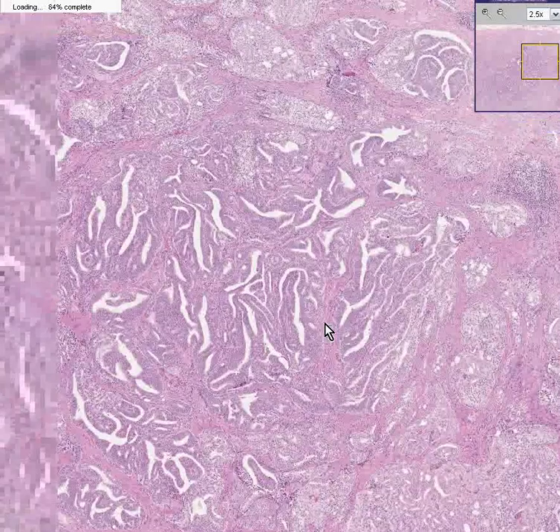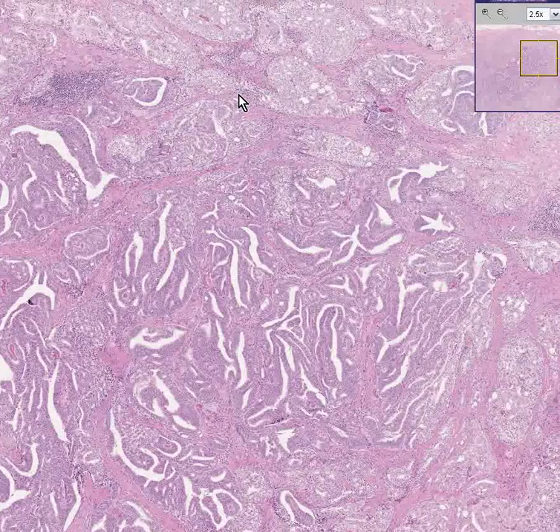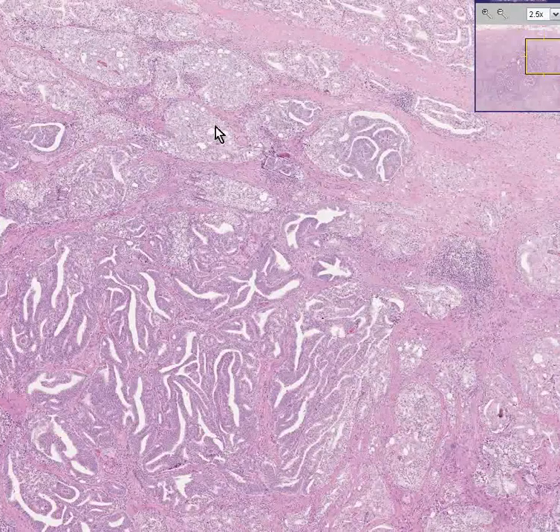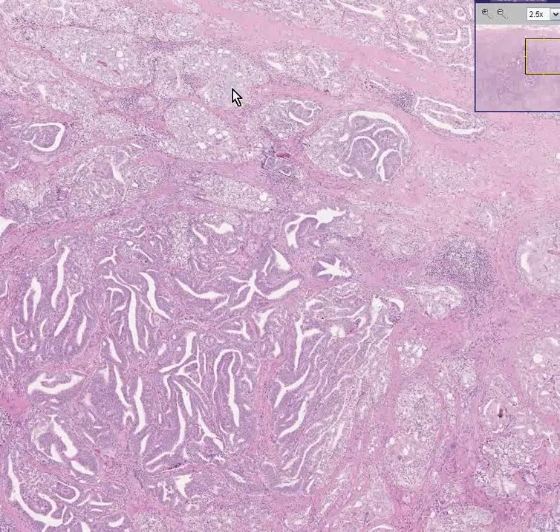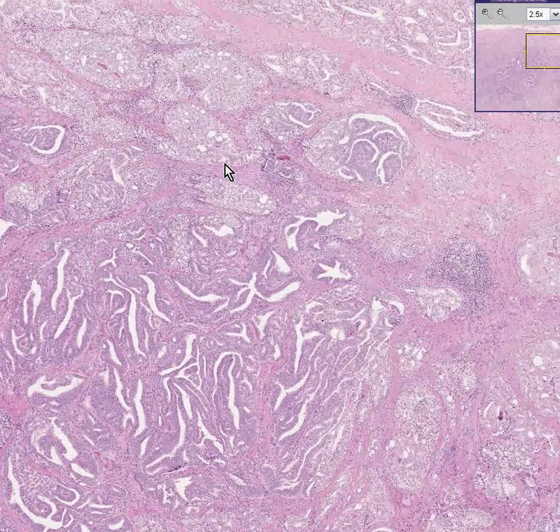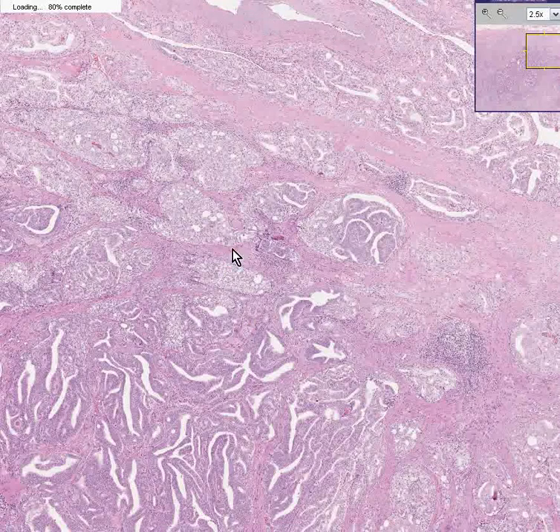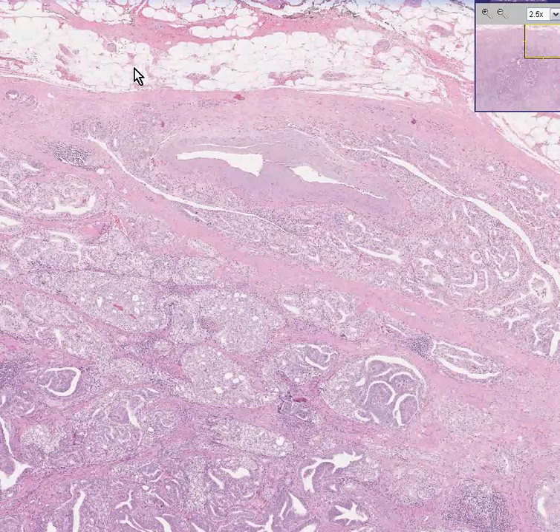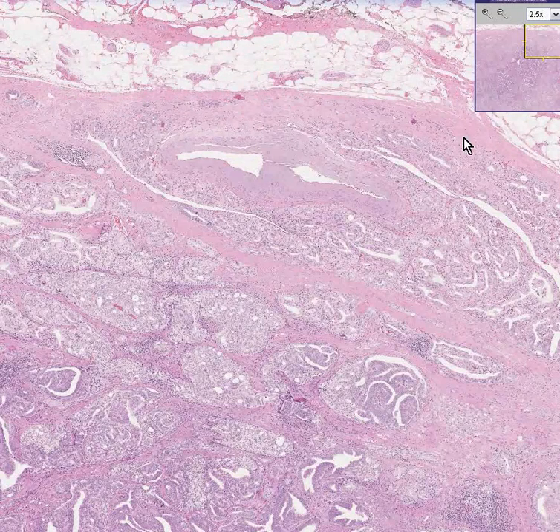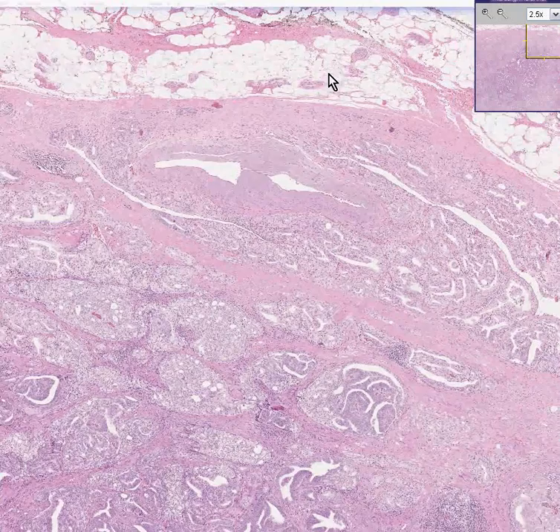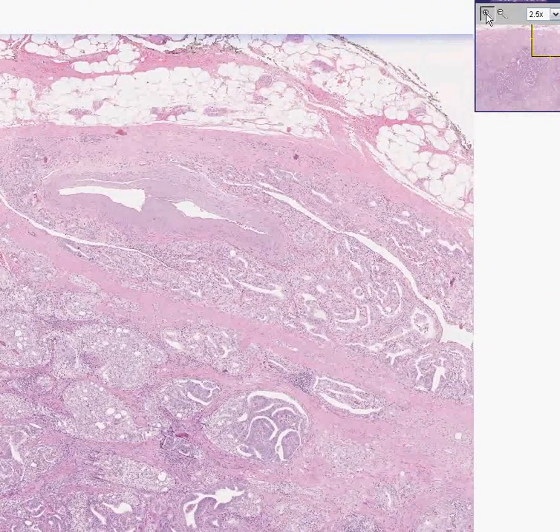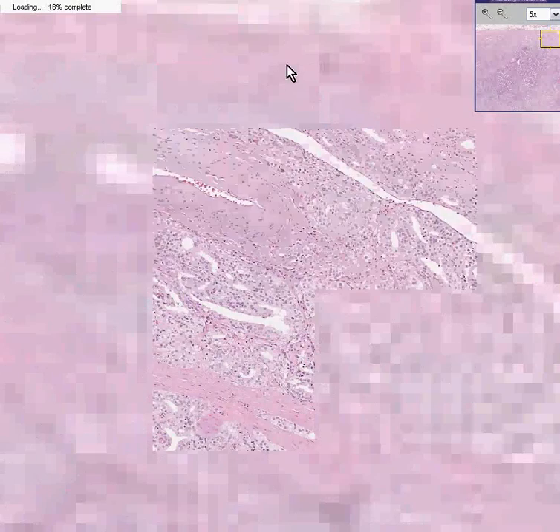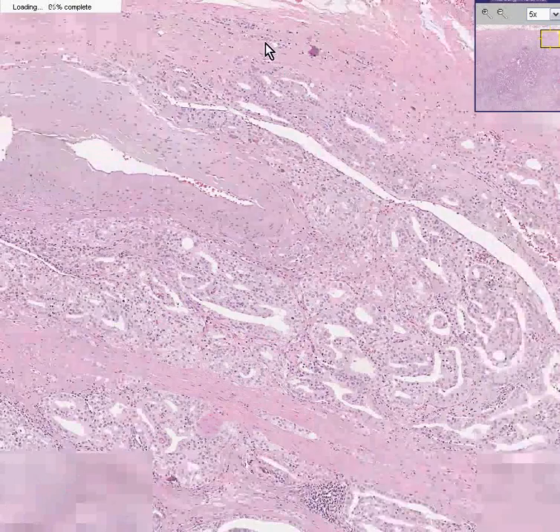They are just irregularly infiltrating all over the place and they are so poorly differentiated, hardly forming glandular structures. Another thing you could notice is that here's the capsule of the prostate, because beyond that is just your normal connective tissue, nerves, blood vessels.